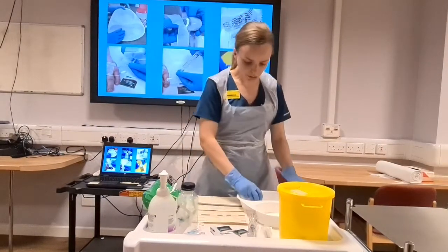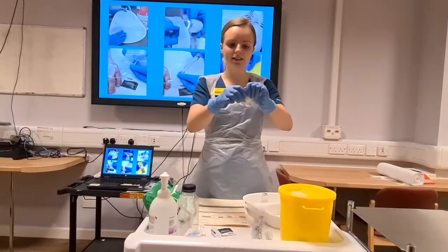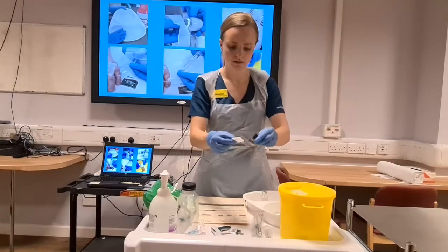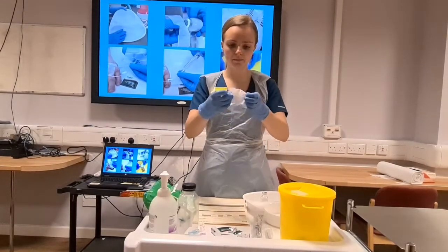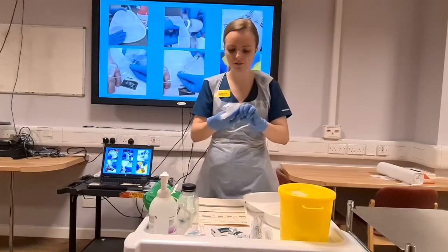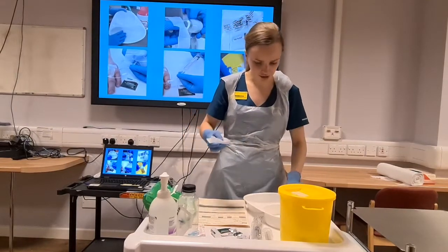I'm going to get my vial. I'm going to flick off the cap. Then I'm going to get my 2% chlorhexidine wipe, opening the wipe up completely, giving it a really good scrub, using different areas of the wipe. Leave it there to dry.